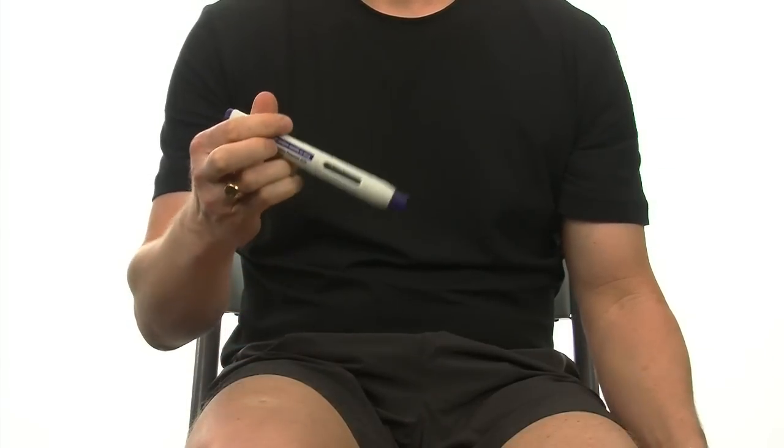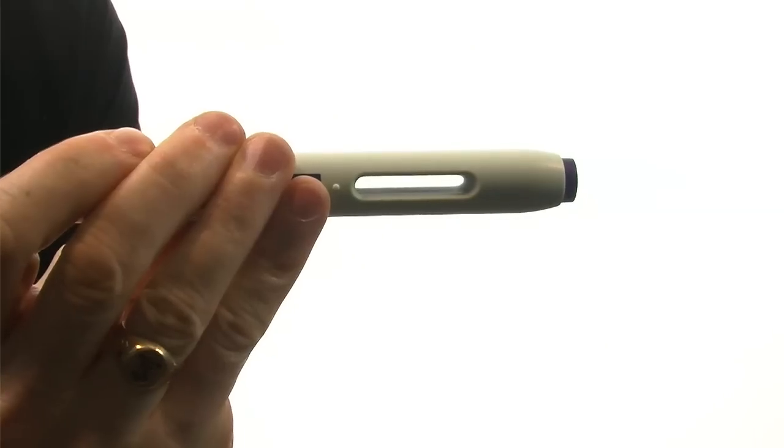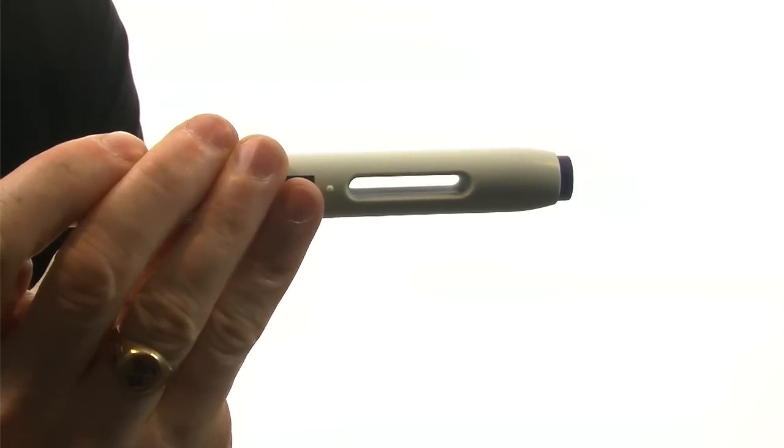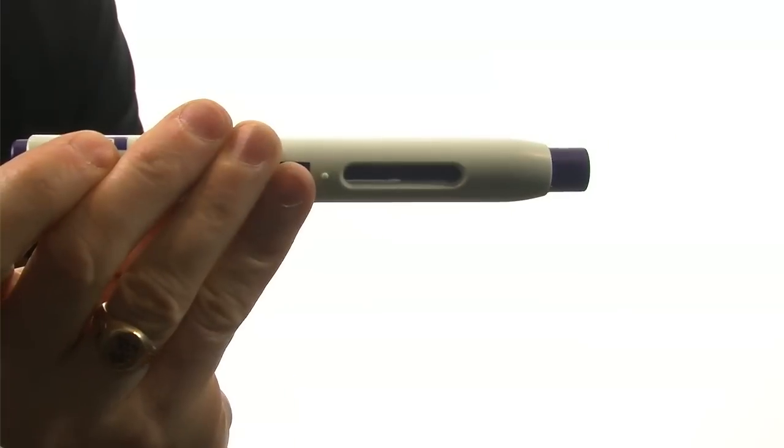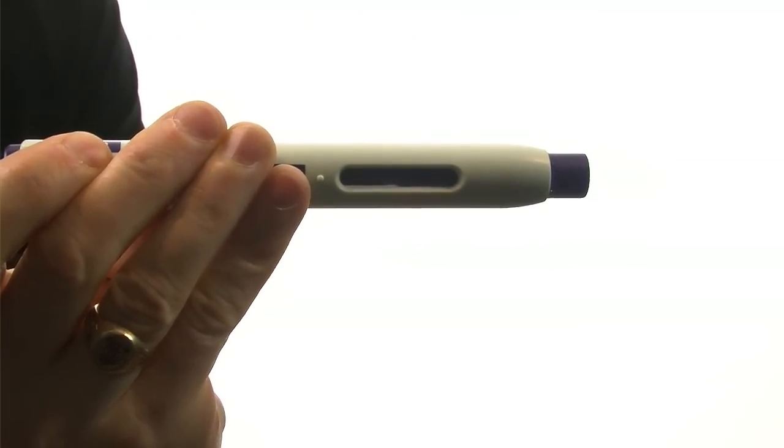When you've reached 15, remove the auto-injector and look at the medication window. It should have changed color. You can no longer see the clear liquid. It should be replaced by the color of the plunger. Apply pressure with a cotton gauze or tissue for about 10 seconds. It's normal to see a tiny drop of blood.